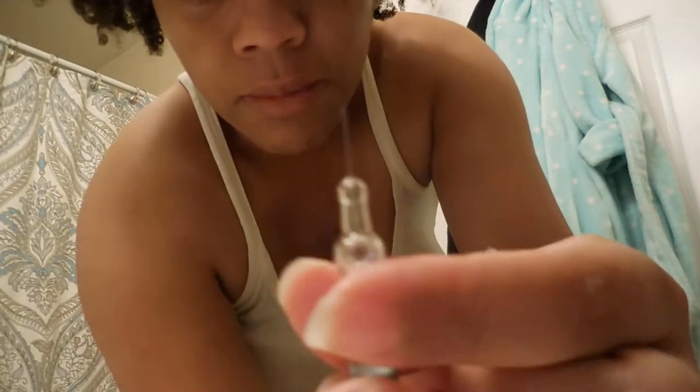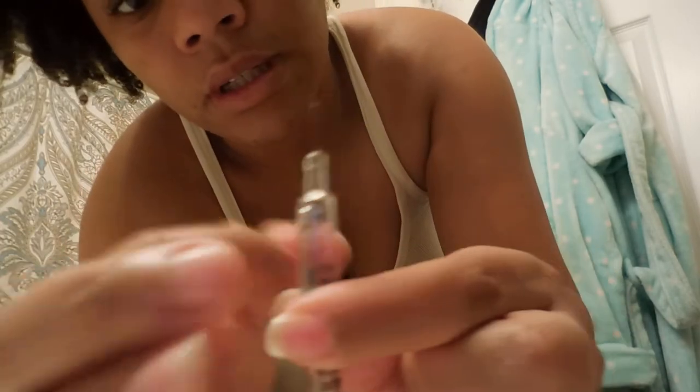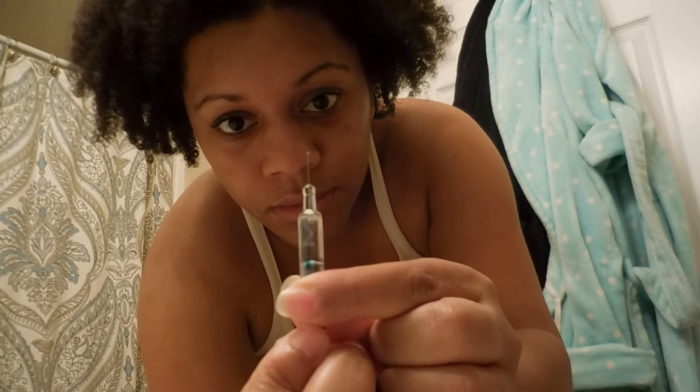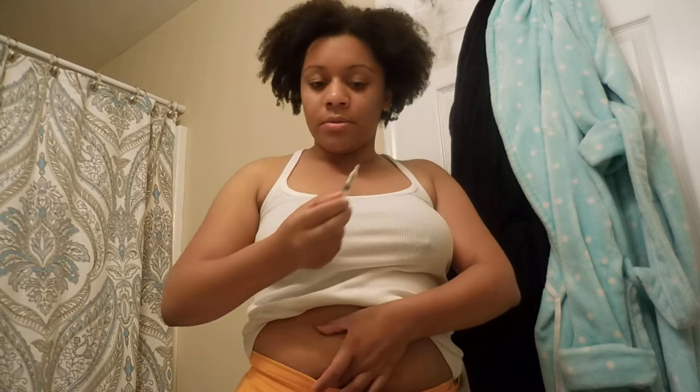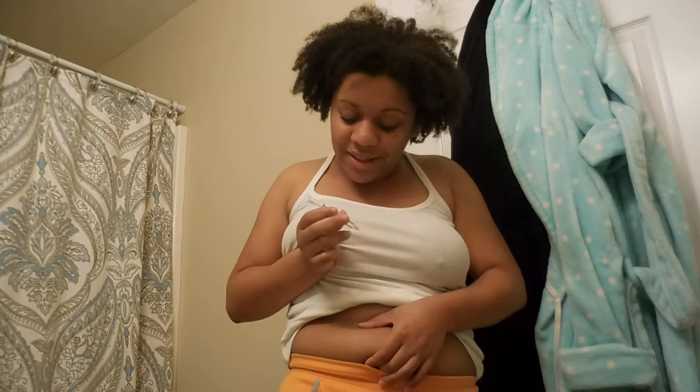So I got the cap off. Remember to do a bevel up. Get that air bubble out. And there we go. Now I am getting nervous. I'm going to do about an inch or two away — I'm going to pick right here from my belly button. And here we go. It's already dry, so I just got to shoot myself up now.